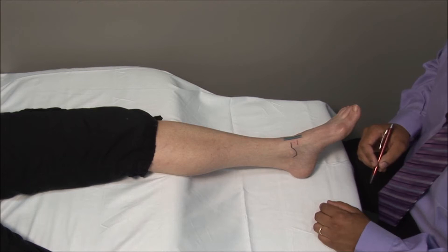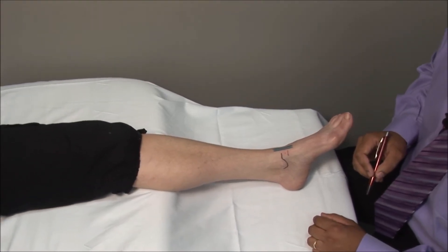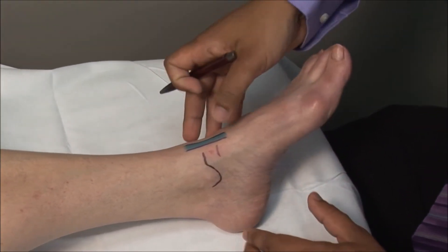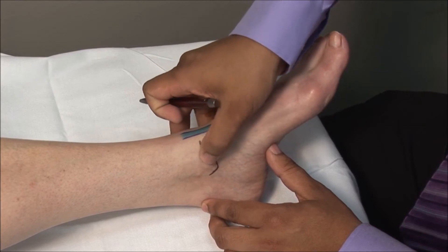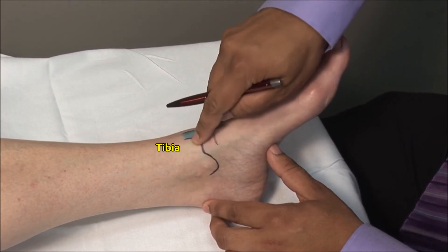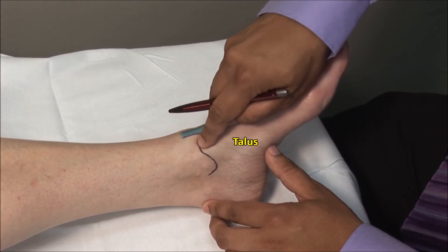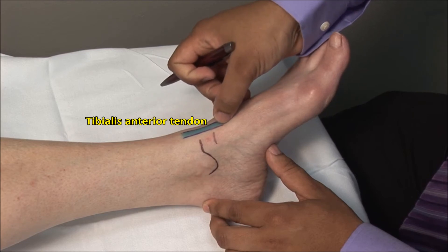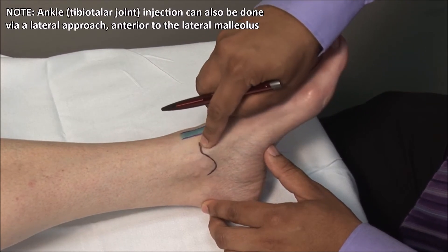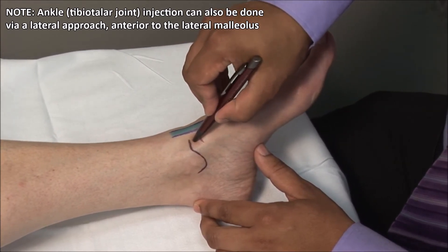Ankle injection can be done with the patient supine and the ankle in neutral position. Identify the soft spot on the anteromedial aspect, anterior to the medial malleolus and between the tibia and the talus, and just medial to the tibialis anterior tendon. Make a mark about one centimeter above the talus and just medial to the tibialis anterior.